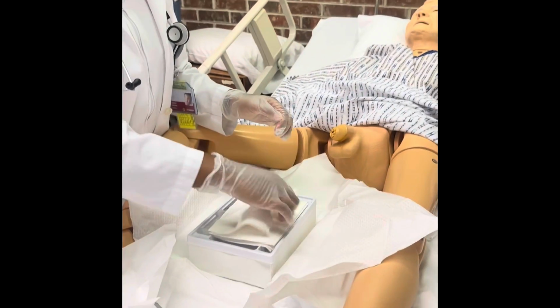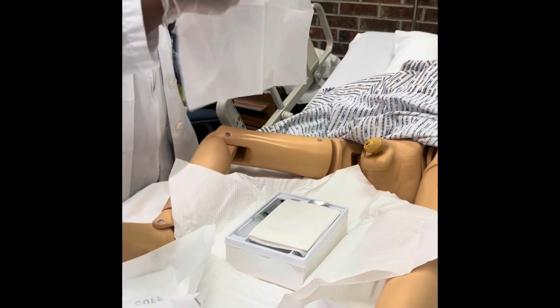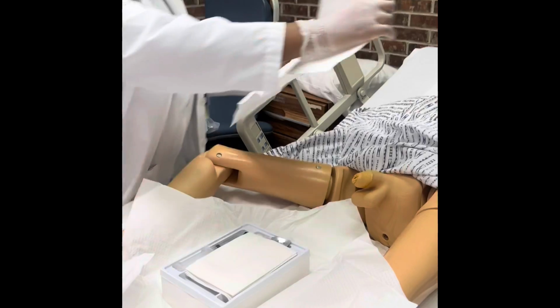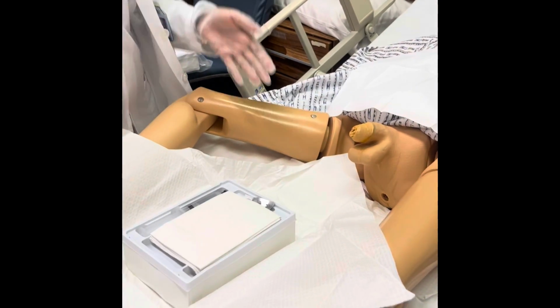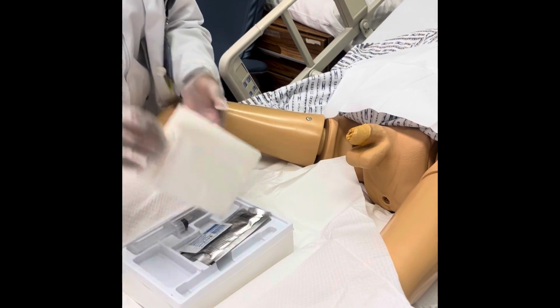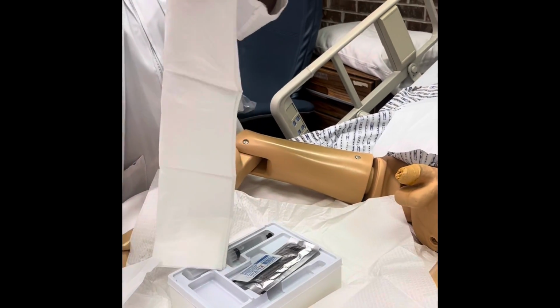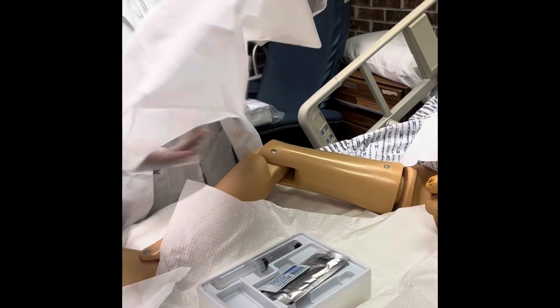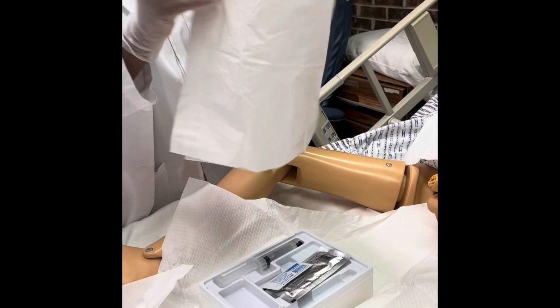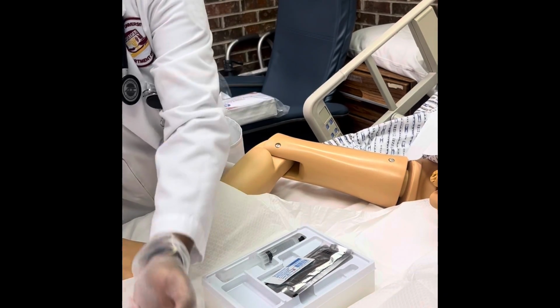Okay, so the first thing in my Foley kit is a drape, which I can use to either put under my patient or on top of it. I'm going to put it on top of them to make my sterile field bigger because you already had the pad up under them. And I also have this, which I can drape over this private part if need be, but I'm not going to glue it because it tends to get in the way when cleaning with the iodine. So I can trash that.